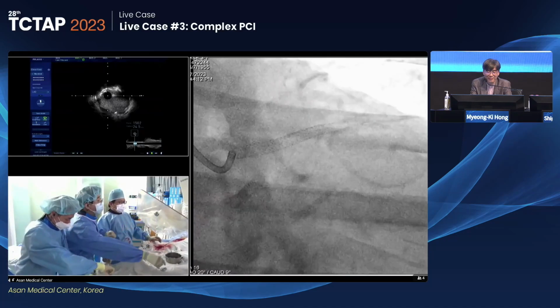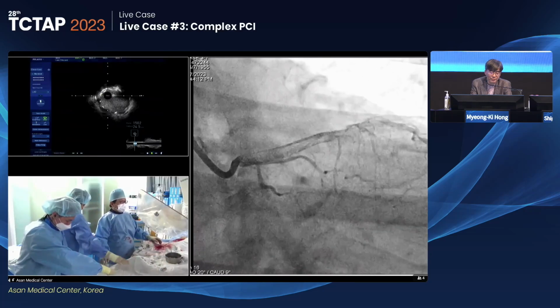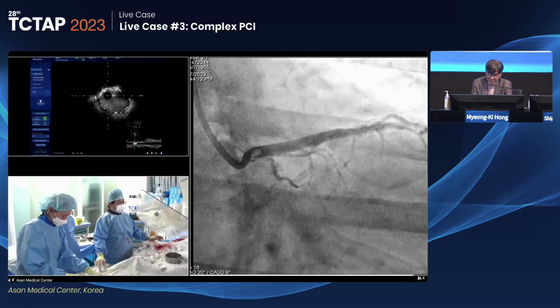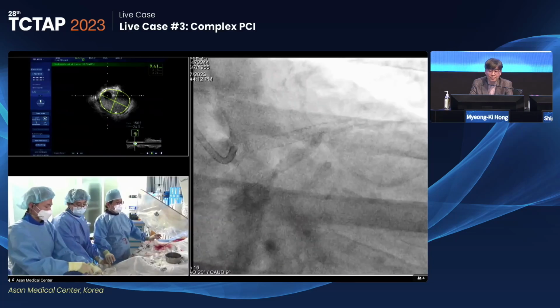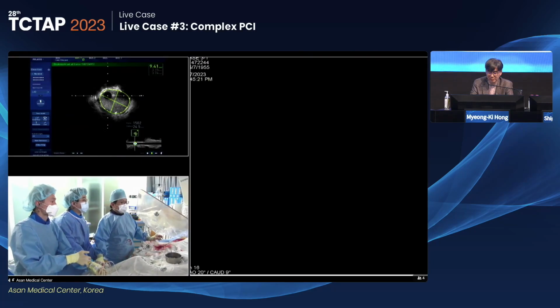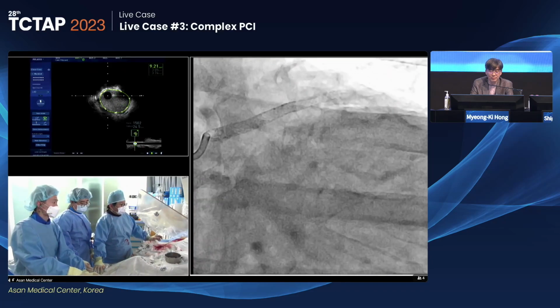Nitro, please. Could you show us a spider view? Yes, just a moment. After the nitro, ready? Yes, ready. And I don't think there was a technical error on the first PCI. It was just recurrent disease.